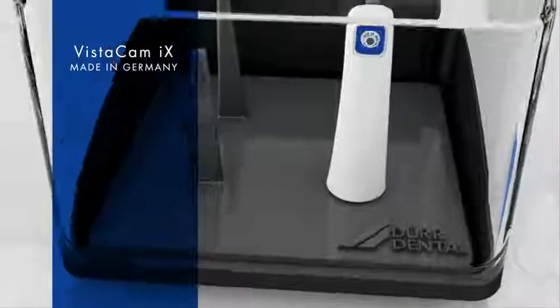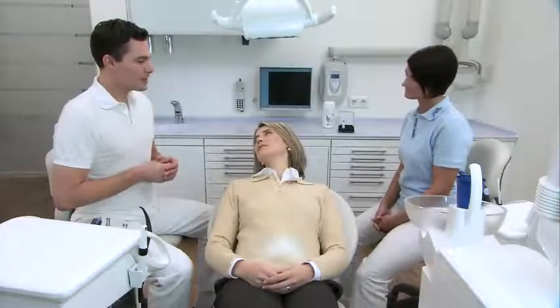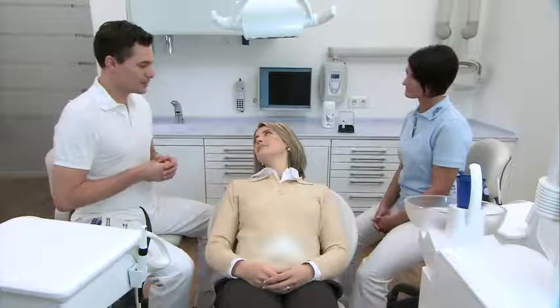Camera systems by Durdental provide valuable help for dental treatment. They enhance the patient's understanding of the treatment that has to be carried out and help the practitioner in making a diagnosis.